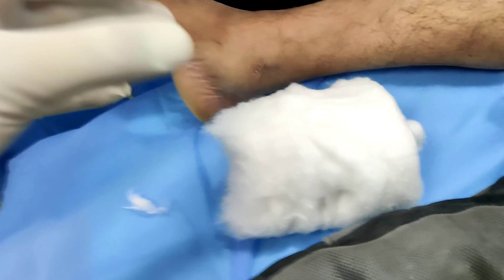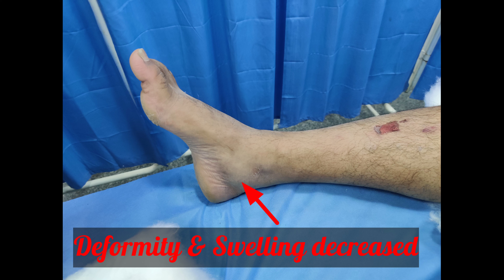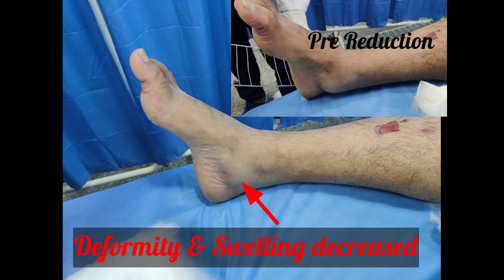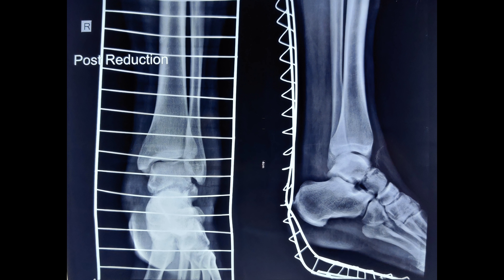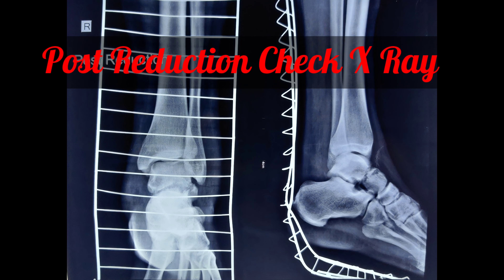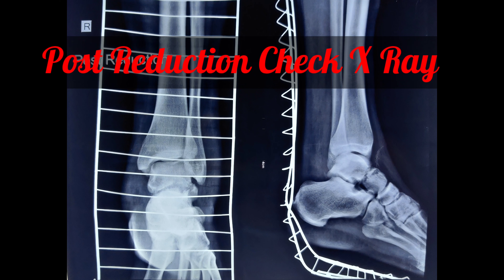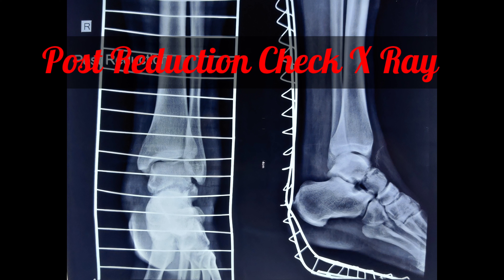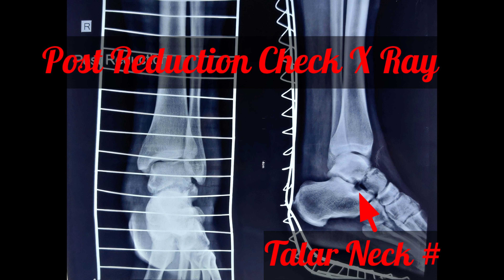As soon as the reduction is complete, there is a substantial decrease in the amount of swelling and deformity compared to the pre-reduction photograph of the same patient. A below-knee back-slab splint was then applied and a check x-ray was taken. The x-ray shows that the lateral subtalar dislocation has reduced, and the talar neck fracture is still present, which will require open reduction and internal fixation.